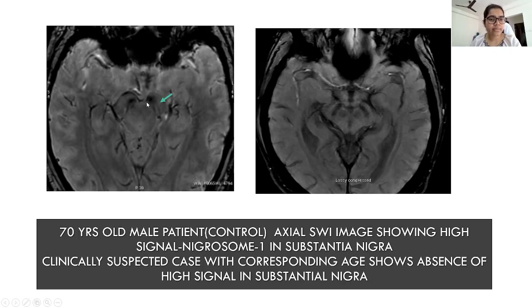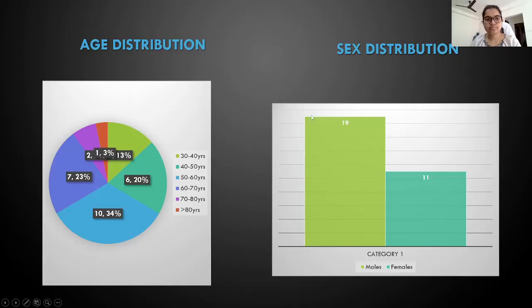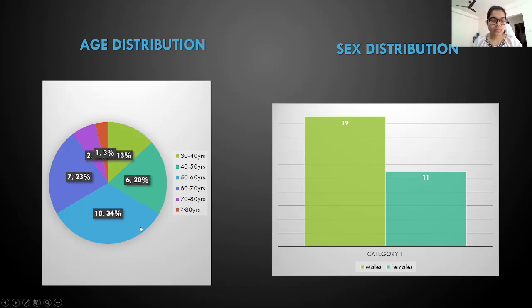Here is an MR axial SWI image of a 70-year-old male control showing high signal nigrosome 1 in the substantia nigra on the left side indicated with a green arrow. A clinically suspected case of corresponding age shows absence of high signal in the substantia nigra on either side.